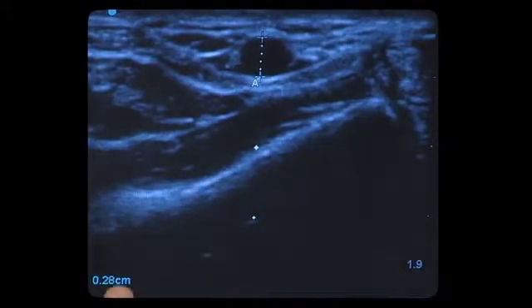As you can see in your case — yours is 2.8 millimeters. A diameter of 2 millimeters or greater in the radial artery is acceptable and good. It is safe to accommodate a 5 French sheath, which is the most common size of plastic tube that we place through the radial artery.